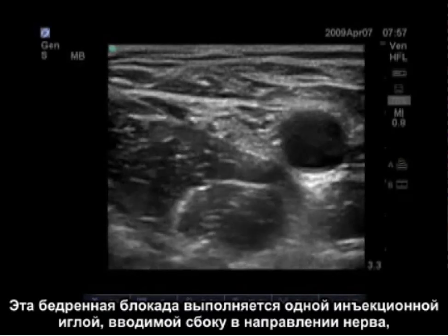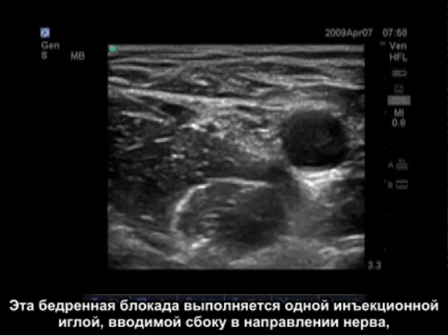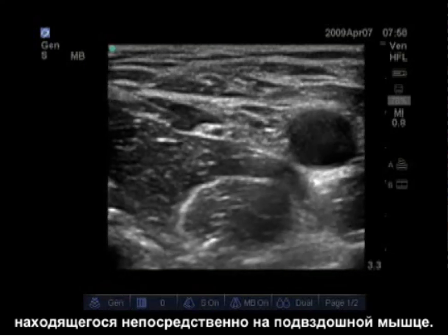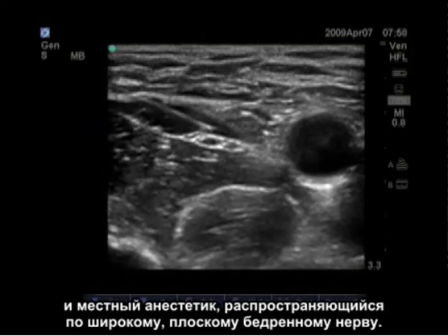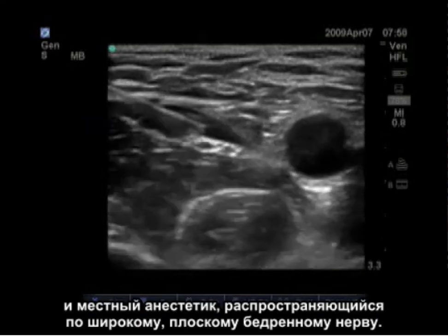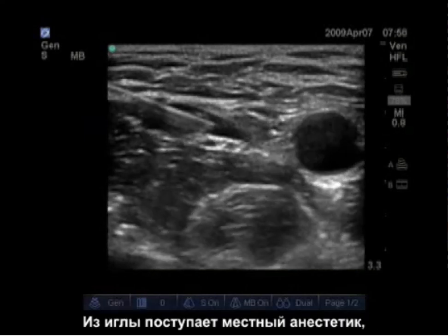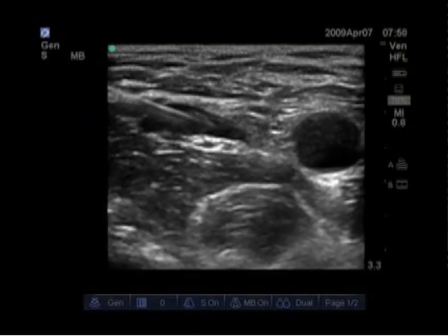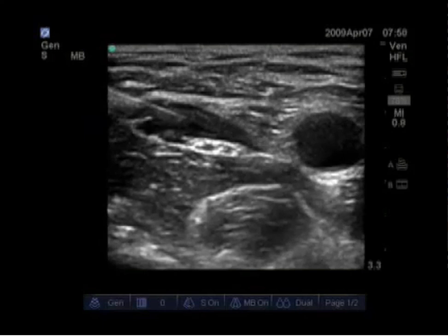In this femoral nerve block, you can see a single injection needle being advanced lateral to the nerve, which is lying right on the iliacus muscle. You can see the pulsating femoral artery medially and the local anesthetic now spreading over the wide, flat femoral nerve. The needle tracks in with the local anesthetic so we can get local anesthetic spreading all the way medial around the femoral nerve.